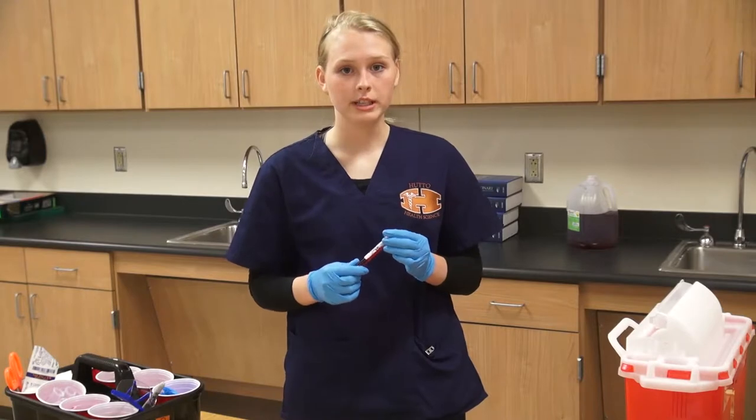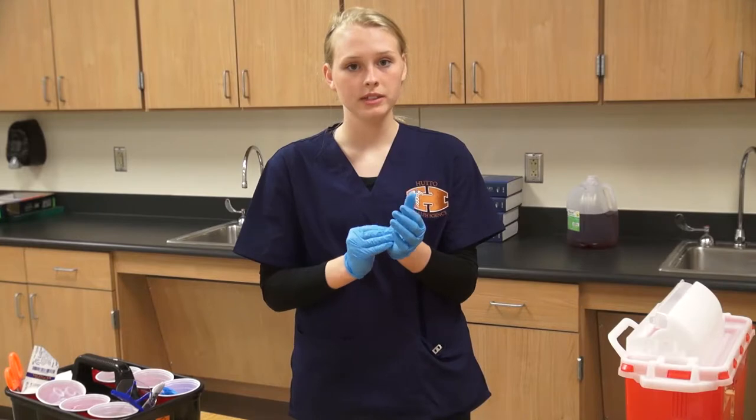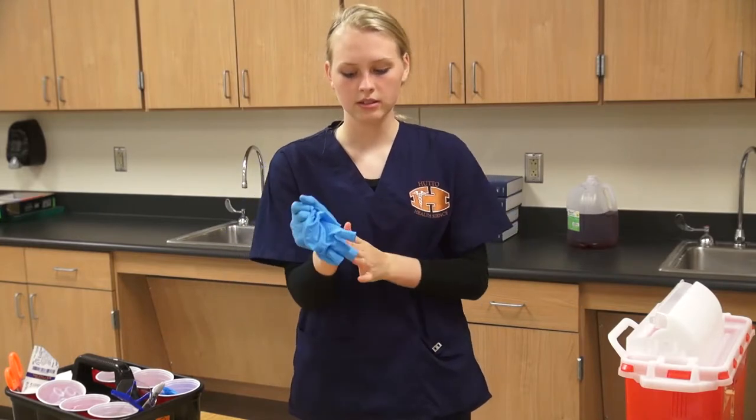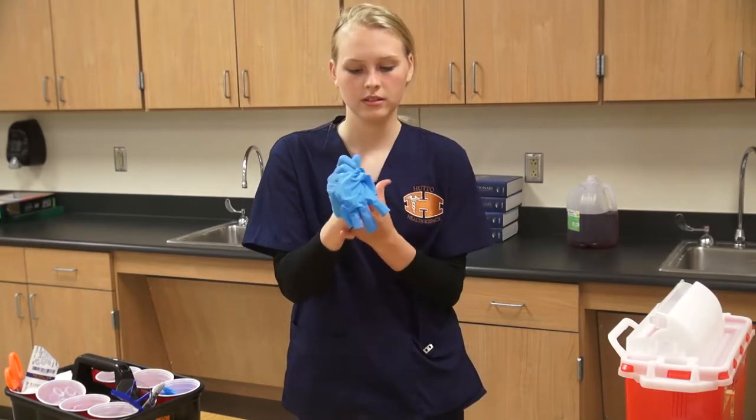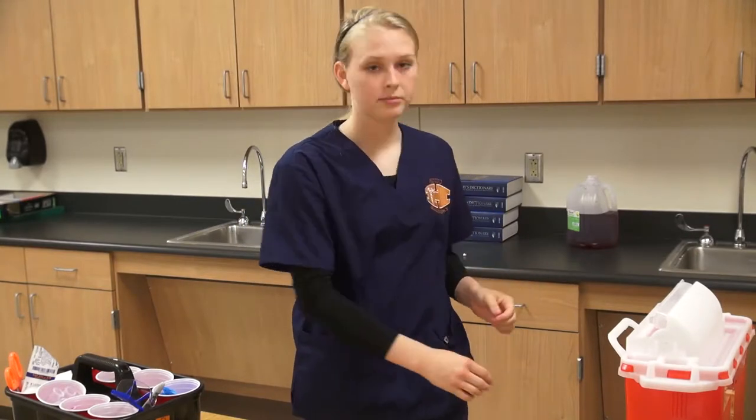The vacutainer will then be sent to the laboratory for testing. Make sure to remove your gloves, dispose of them properly, and wash your hands again. Before every blood draw, a phlebotomist must properly wash their hands following the CDC guidelines mentioned in the hand washing video.